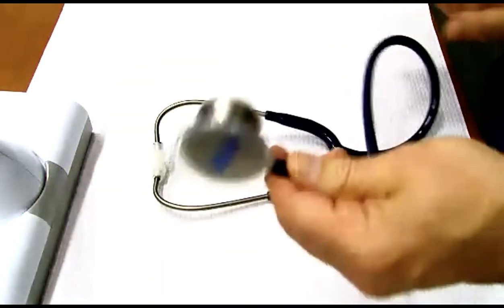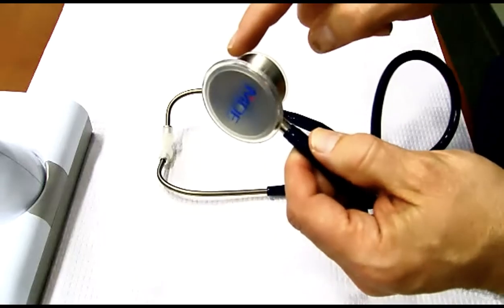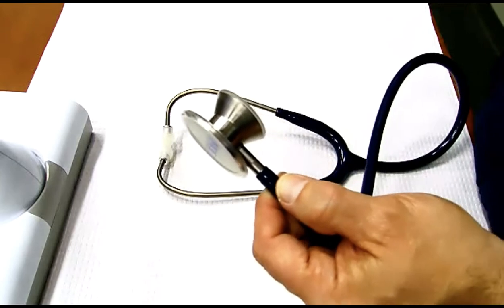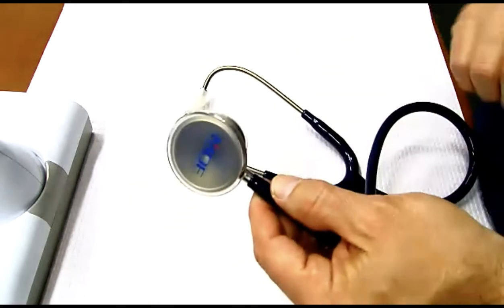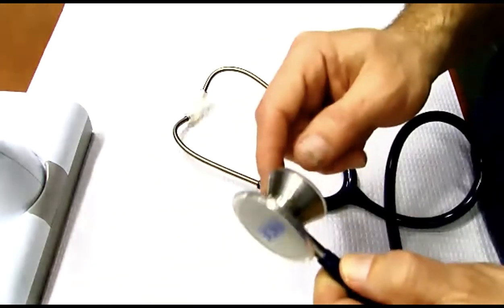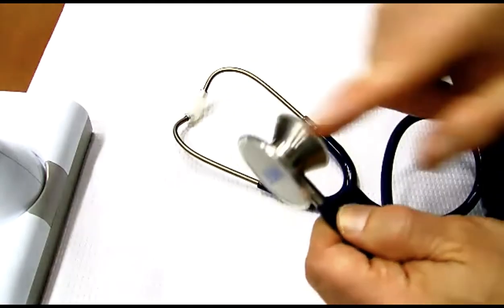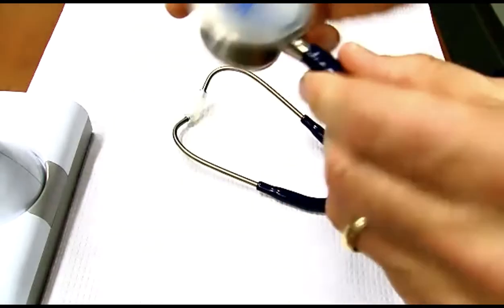All right. Now, tune back in. I know I've lost some people here, but I said your stethoscope can conduct sound from either the bell or the diaphragm, but here's the answer: not at the same time. So the number one problem, and the second most common problem for why you can't hear anything, is that you're using the bell, but you've set the stethoscope to work on the diaphragm. So you need to know which of these two your stethoscope is set to have the sound from. So how are you going to know?